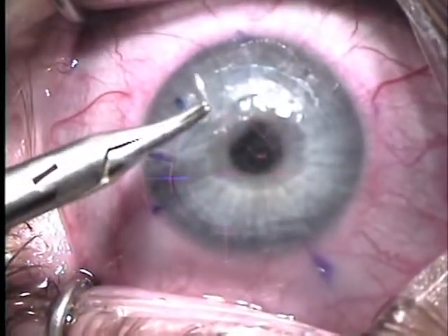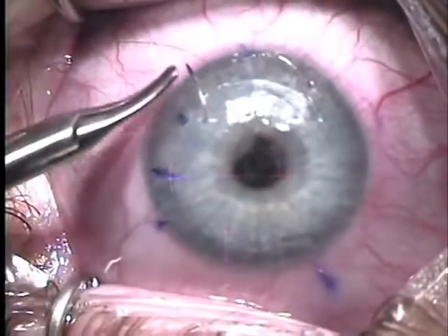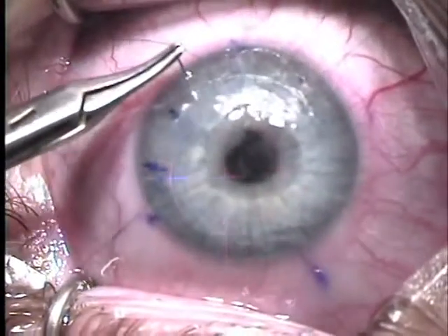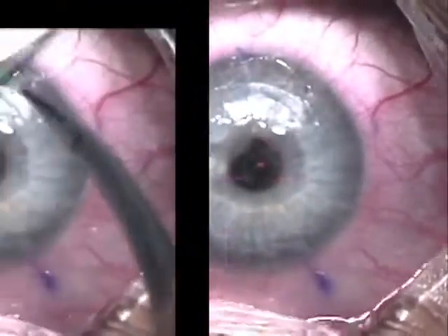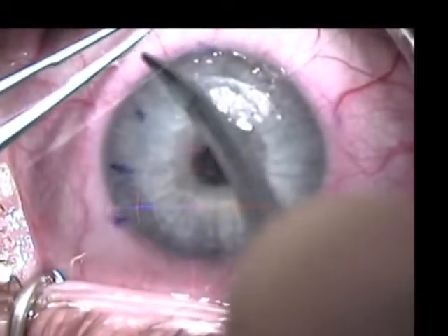This flap had necrosed inferiorly, so a total of 8 interrupted 10-O nylon sutures were placed in an attempt to prevent any additional epithelial ingrowth.